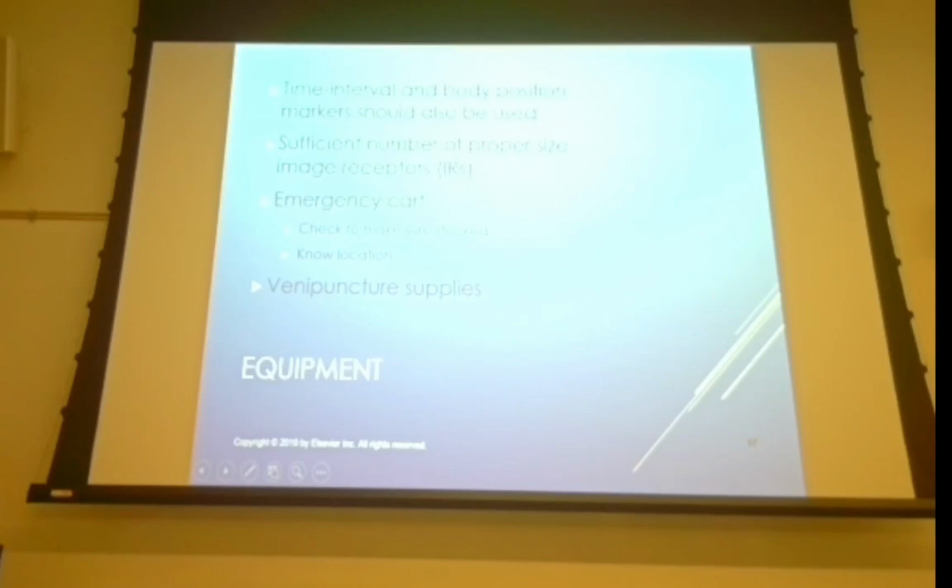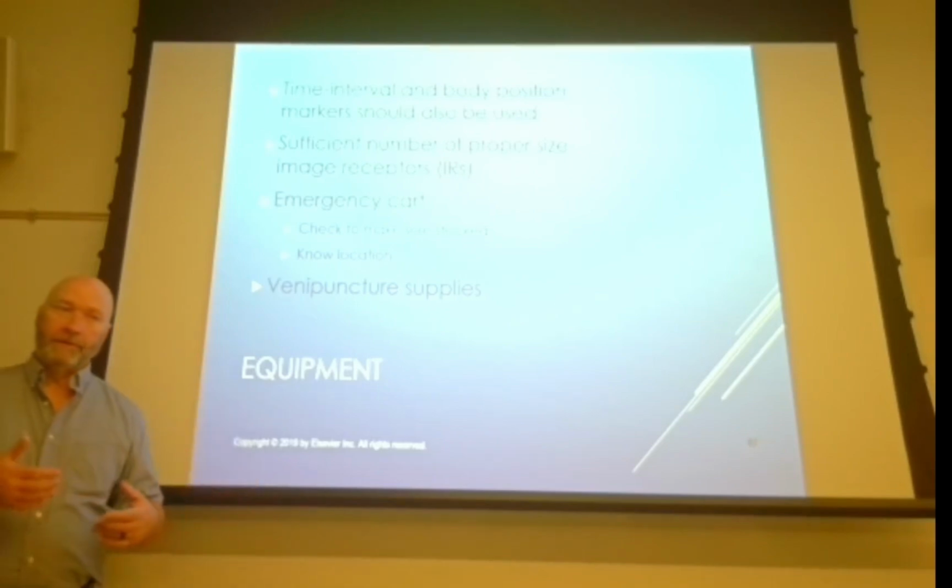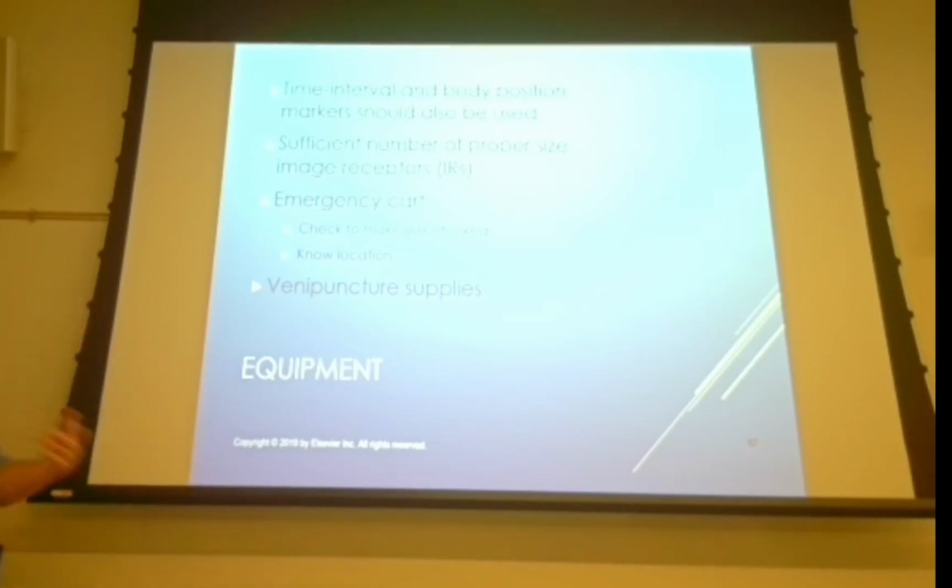Once you inject into the patient, you're going to shoot multiple exams, usually 5 minutes apart. You're going to do some obliques, and you're also going to have the patient get up, go to the restroom, urinate, and come back, and you'll take, in this case, a post-void. It's not a post-evac, that's colonic. So post-void is the last view that you take. Some of your radiologists might want you to shoot that one with the patient upright to look for bladder prolapse, especially in moms. Another thing your kids give you is a nice bladder prolapse in some cases. So I want you to do it upright.